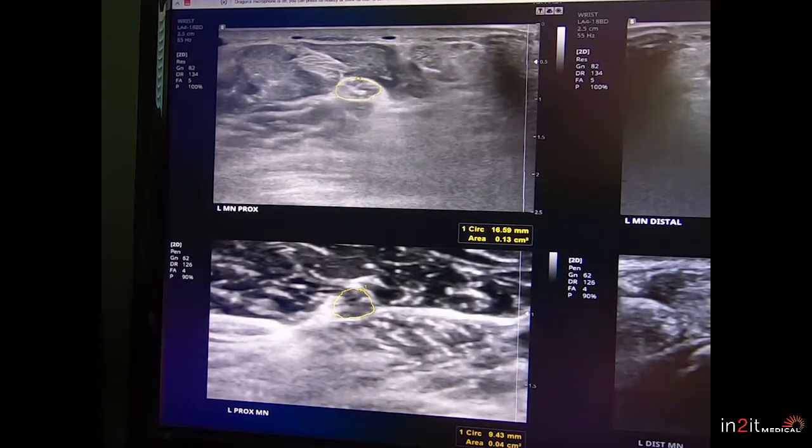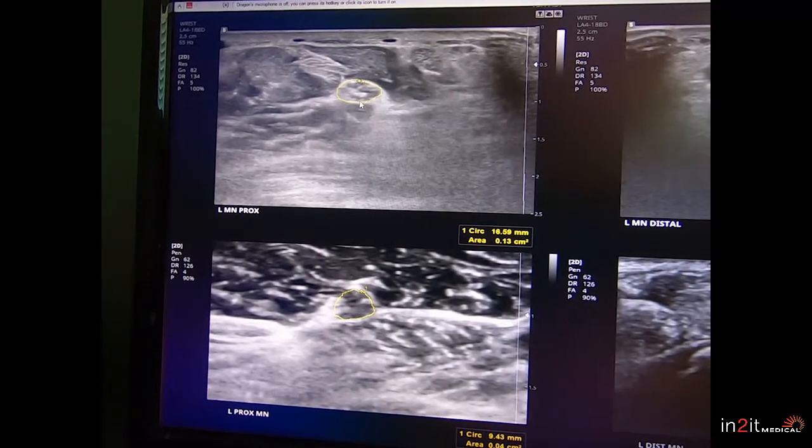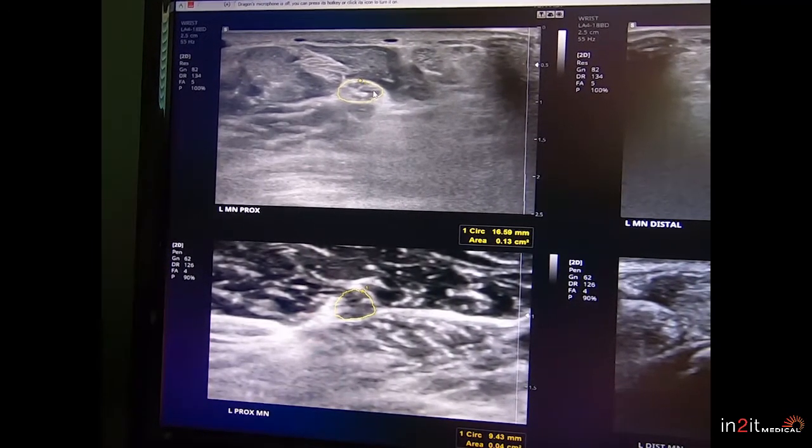I wanted to take a minute to show you some ultrasound pictures of median nerves in the case of carpal tunnel syndrome. Sometimes carpal tunnel syndrome isn't always as straightforward as you may think it is.